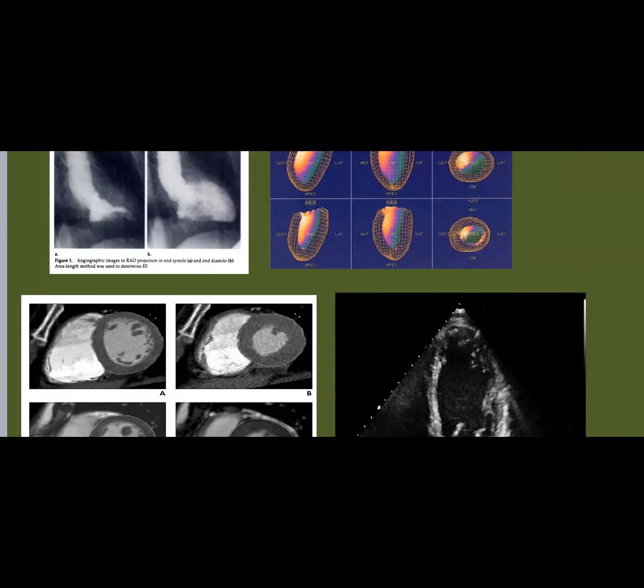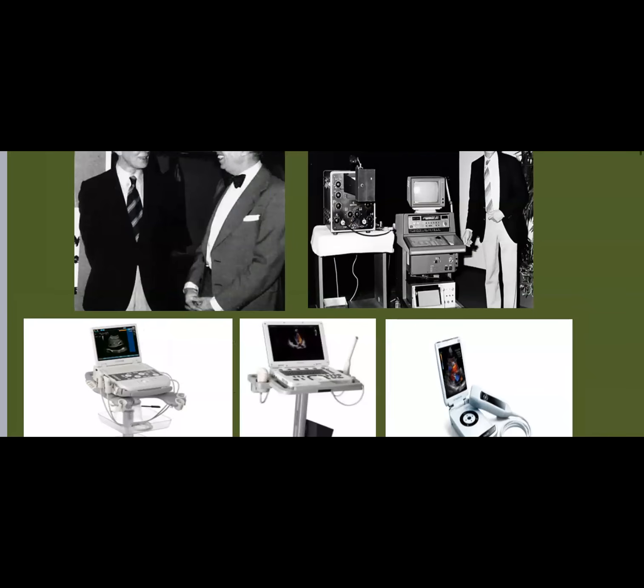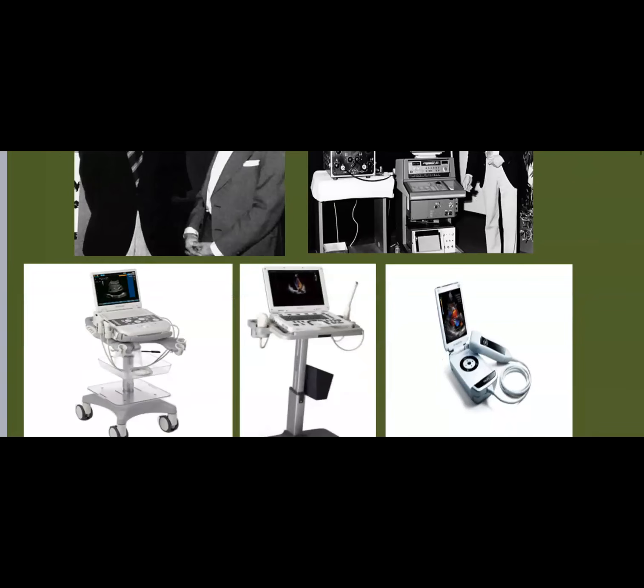Even when we come to the discussion shortly, I will show you how some aspects of echo correlate to and compare with the gold standard. And again, like we said last time, echo has come a really long way.